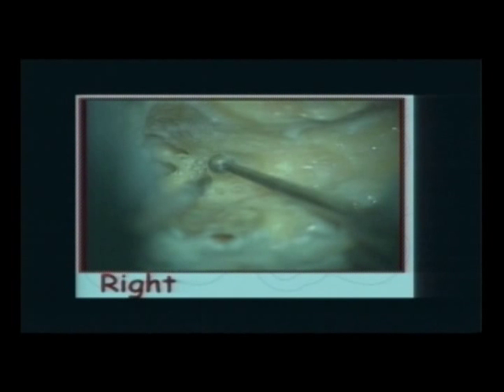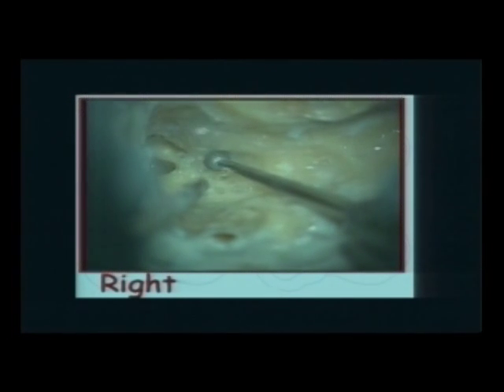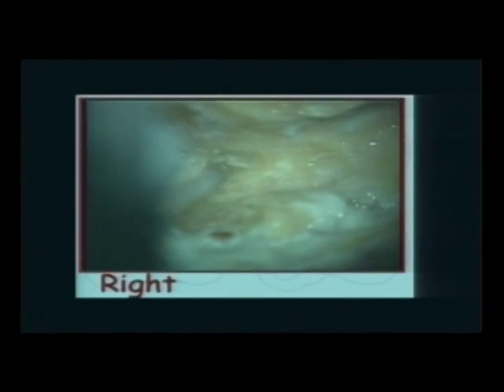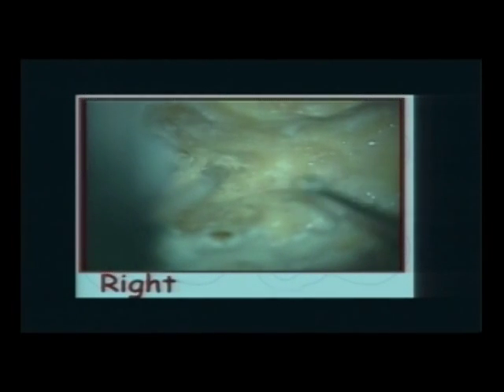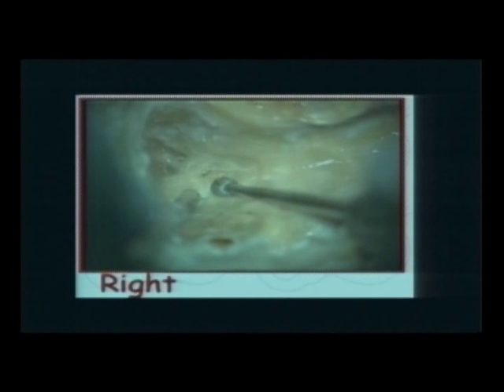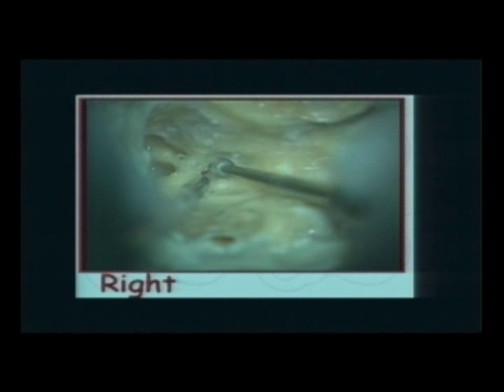You see here, drilling into the posterior tympanotomy. And now you see this white line that's going to appear here. See, this short process points to the facial nerve. It points right there to the facial nerve. These are sentinel cells that have been opened now. And now you're going to see the chorda tympani. You see this white structure? I'm showing. And the facial nerve is going to be right there. This is the incus buttress. And this is the short process of the incus within the fossa incudis. You can see into the whole attic here.